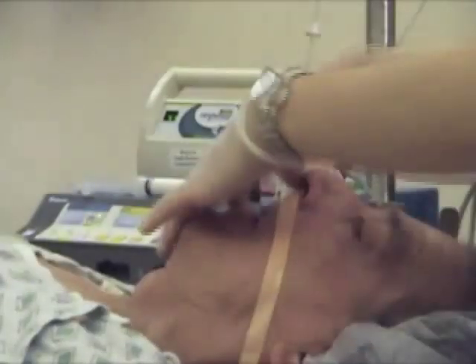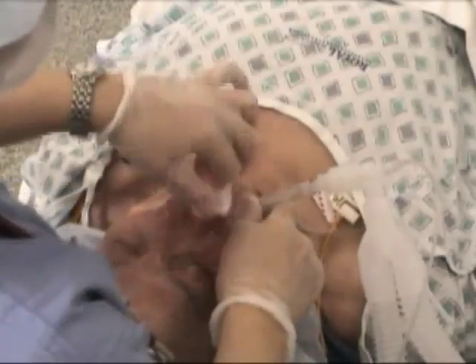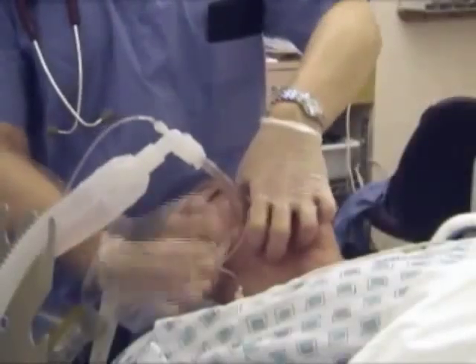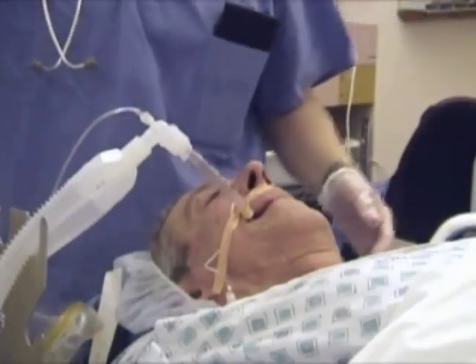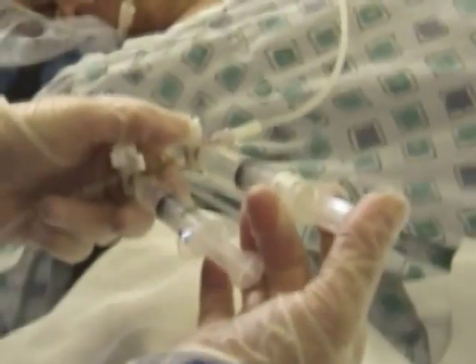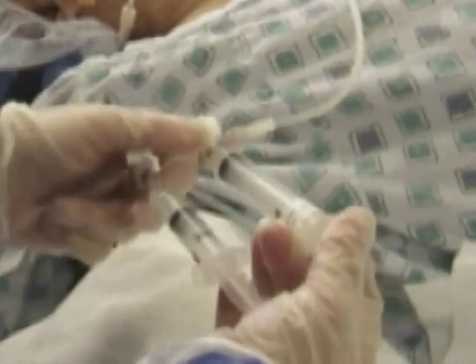First, attach the tape to the patient's cheek, and then wrap it circumferentially around the tube. Next, affix the free end of the tape to the patient's other cheek. Pharmacologic sedation and hand restraints may be employed to prevent inadvertent extubation.